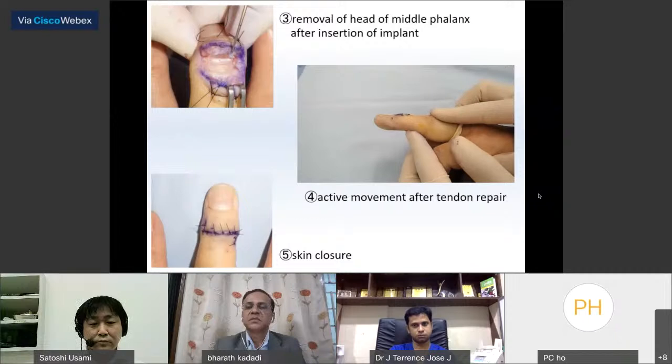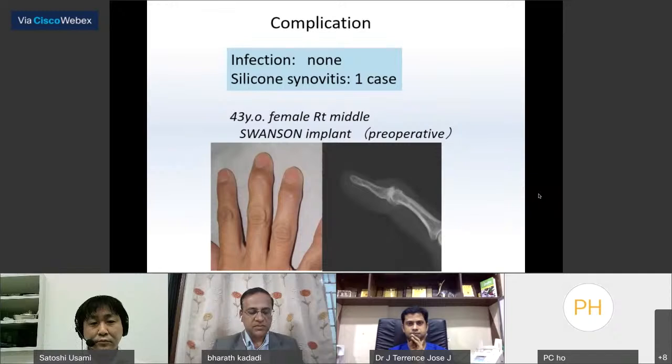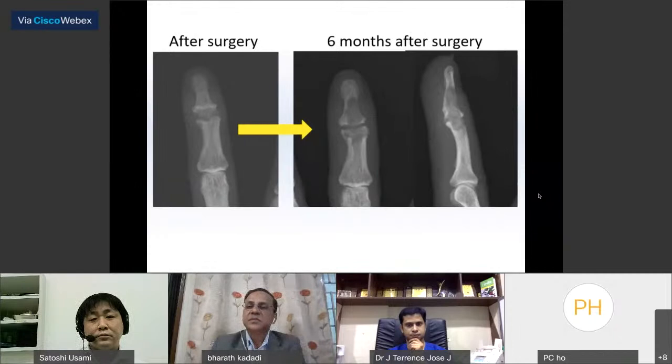These are our outcomes of DIP silicone arthroplasty. In the 55 joints of 18 patients, DIP arc was decreased, but DIP extension loss, MASS score, and QuickDASH score were significantly improved. As for complications, one case of silicone synovitis was observed in a 43-year-old woman who underwent arthroplasty with a Swanson implant. At 6 months after surgery, her DIP joint was swollen, and osteolysis around the silicone implant was identified in X-ray appearance. And finally, this implant was removed.